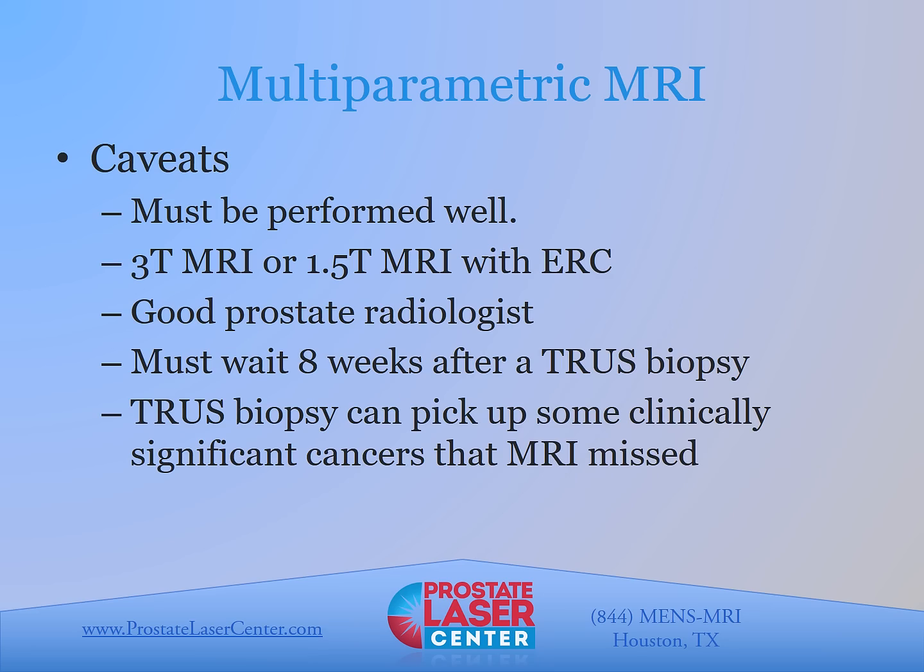There are some caveats. The multiparametric prostate MRI must be performed well: a 3T MRI or a 1.5T MRI with an endorectal coil. The radiologist should be experienced in reading prostates. And one must wait 8 weeks after a TRUS biopsy. Now, a TRUS biopsy can also pick up some clinically significant cancers that MRI missed. So it's important not to use the MRI to exclude all patients from a TRUS biopsy, especially those patients who are high risk.